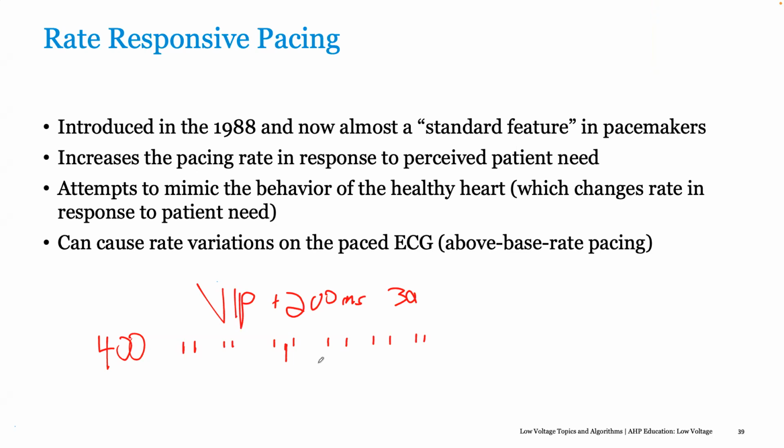I've got a little question. Is that MVP mode available on the third generation Medtronic Spheras, or is this a brand new thing? Because obviously in Nigeria mostly they've just got these Spheras and third gens. Does Julius know, or anyone know?